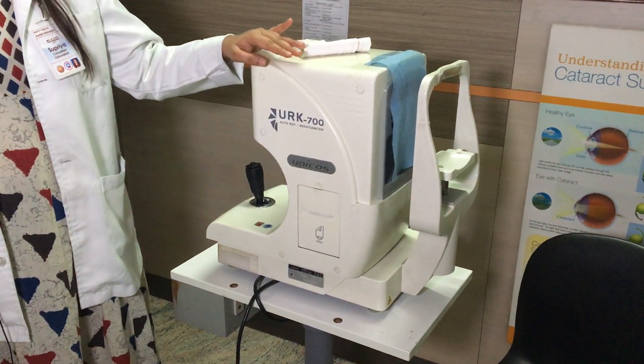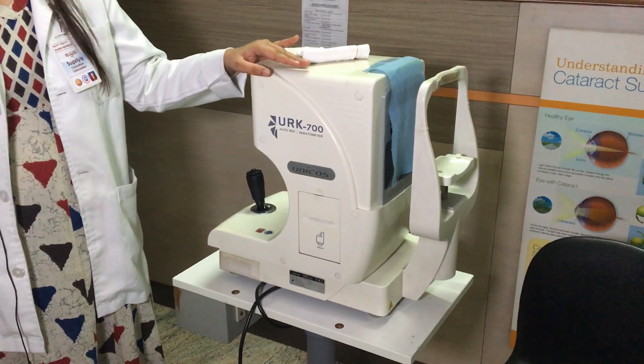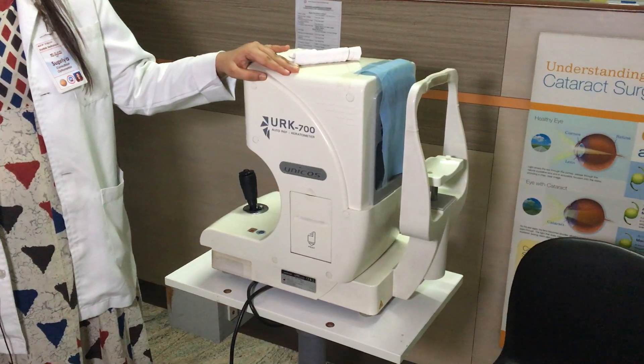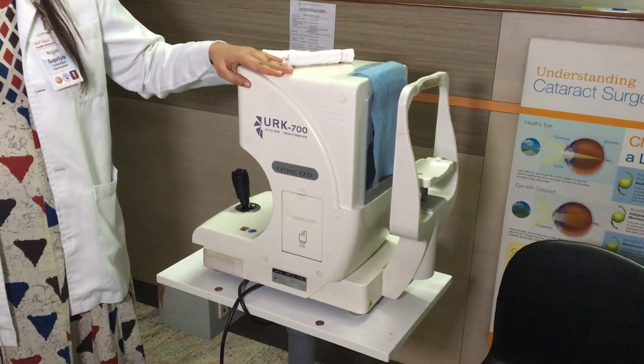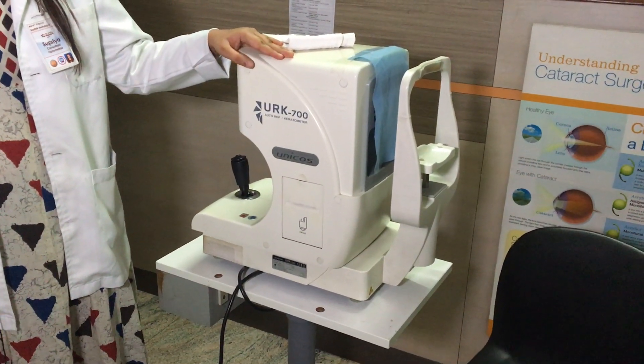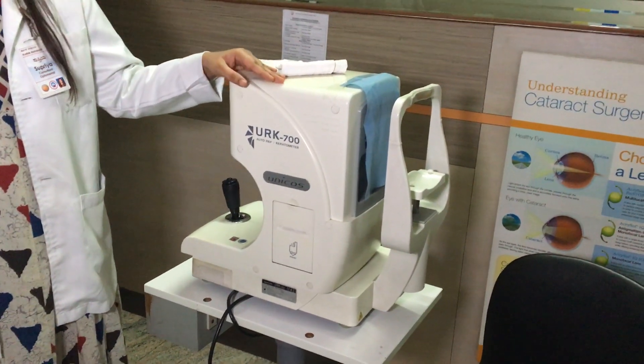There is an approximate refraction value, and a keratometer can measure corneal curvature.